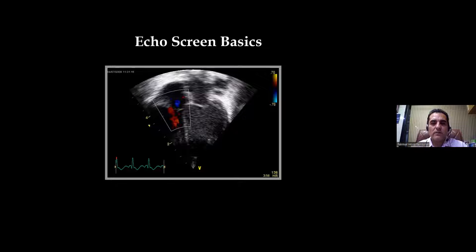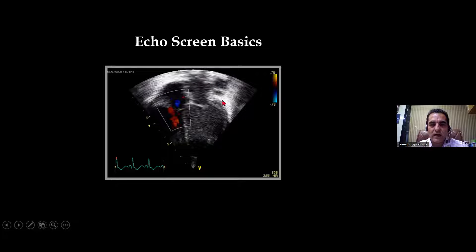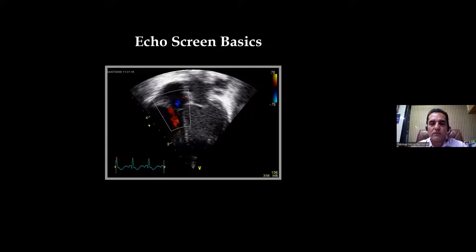The sectoral probe gives us a window like this sector. In that, we see the heart — this is the apical four-chamber view. The image, the view we are seeing, should be an optimized view.